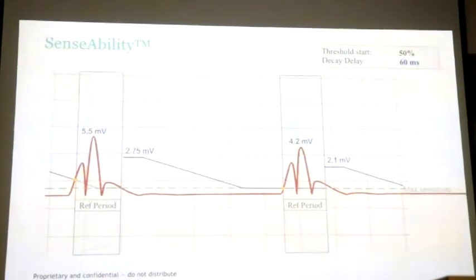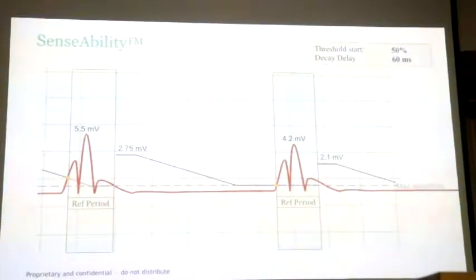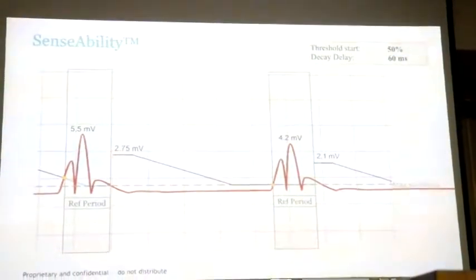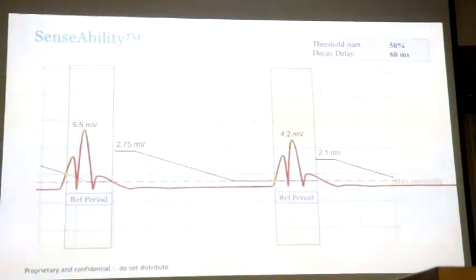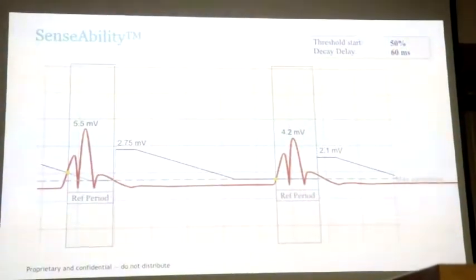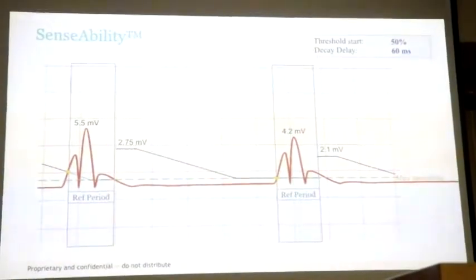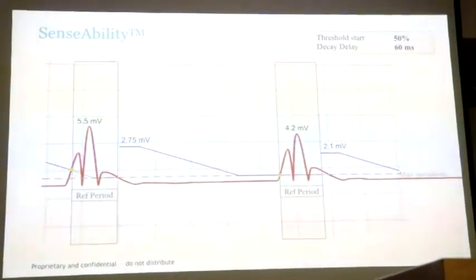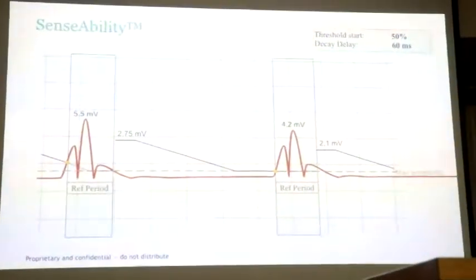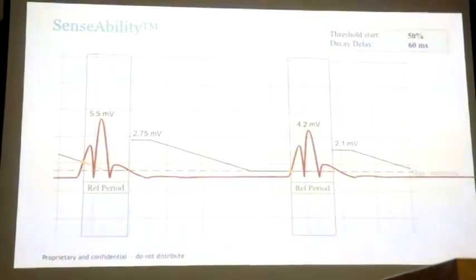Okay, imagine you put this number here to 220, and you could put this to 100%. So you could go all the way up here and hold it for 220 milliseconds, and then it will decline down. It's really insensitive. So we wouldn't advise that. So you want to make minimum changes to get around T wave oversensing. Saying that, it is really rare for an Abbott device today to have T wave oversensing. With our current technology, it's extraordinarily rare to see T wave oversensing when you're sensing.